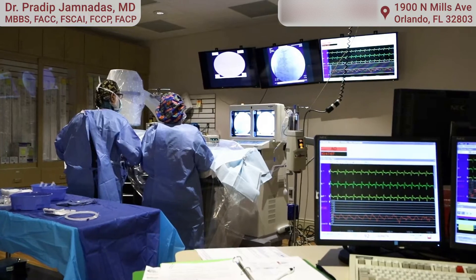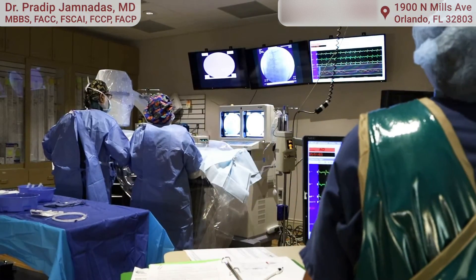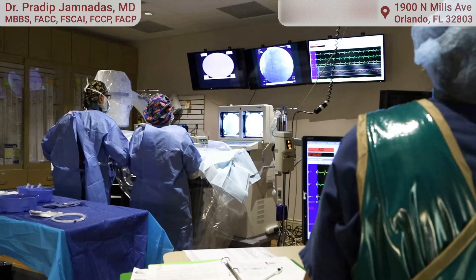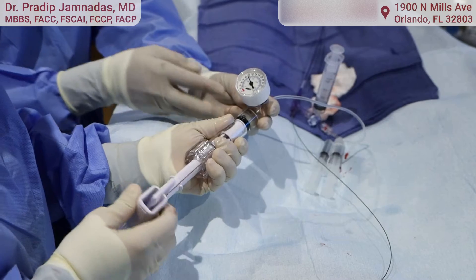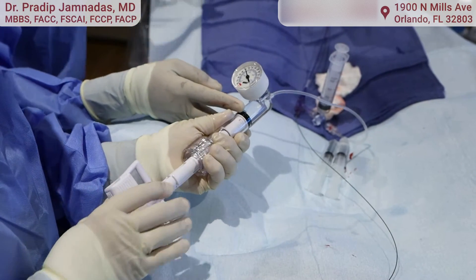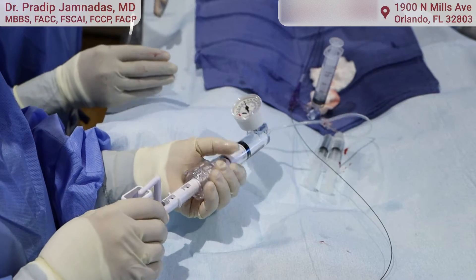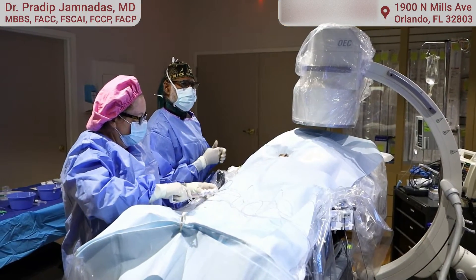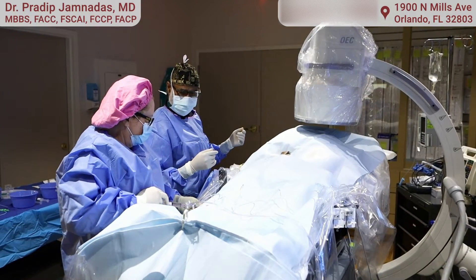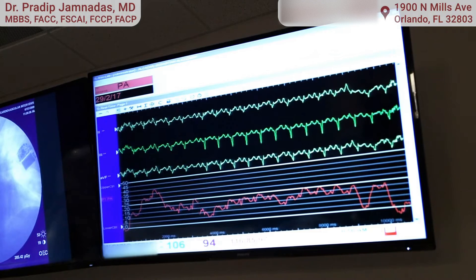Measuring the pressures inside the lungs is very important and usually these patients are wide awake, or they may be sedated if there's a lot of anxiety — just like this patient here who is very happy — and we're going to hook that up to pressure now and see what his pressures are. Measuring the pressures in the heart and the lungs is completely painless; patients don't feel anything whatsoever. Now we're going to see the pressure readings up on the screen.